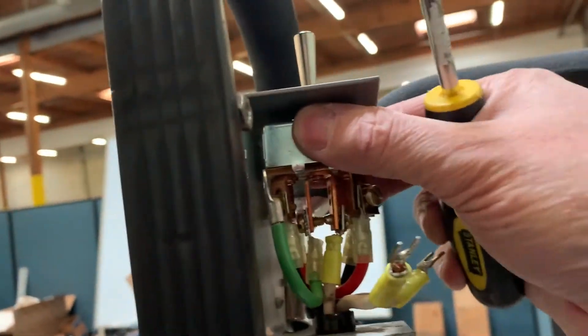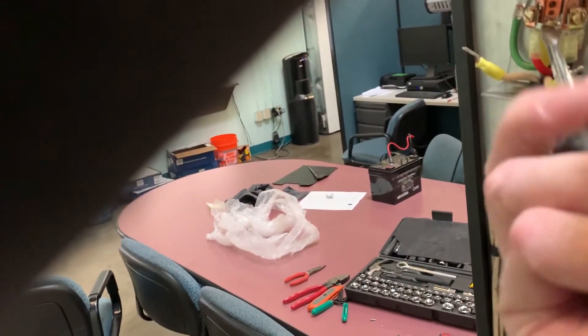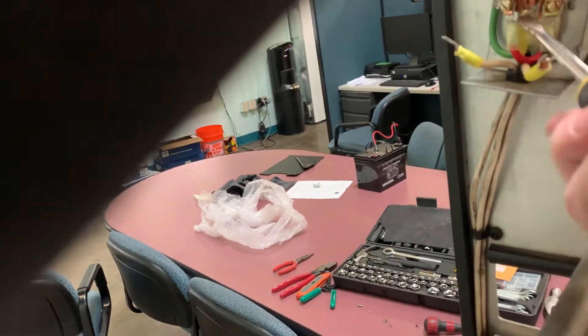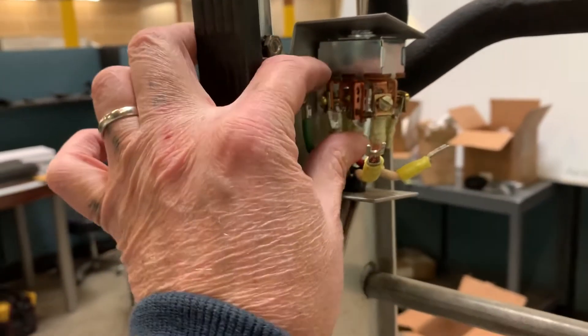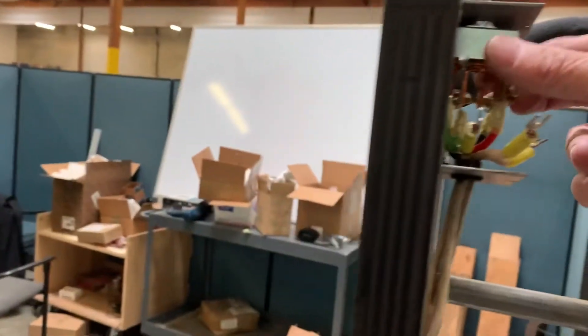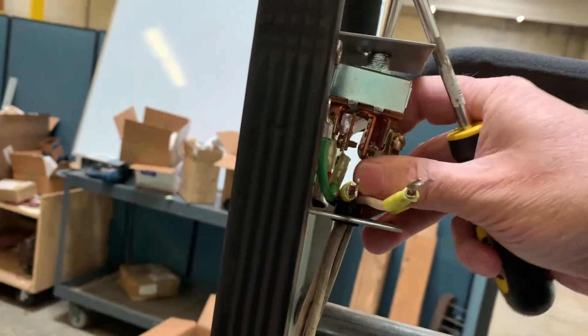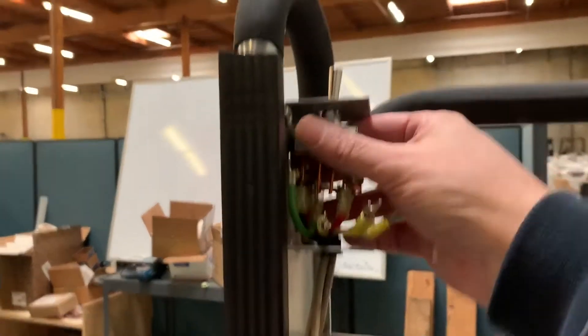You might not be able to get that center one out — let's see if I can. You might have to take the screw all the way out for that center one to come out. All right, so here's the center one — we'll just keep it over here in the middle, kind of out of the way on the left. Just like that. This comes out — get all your wires out of your way. And that one's out.